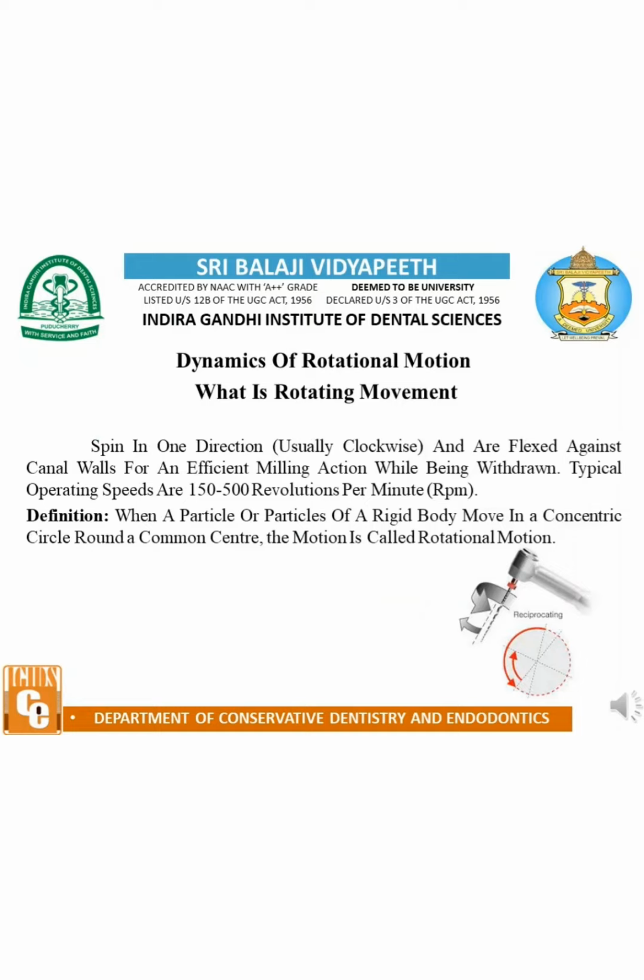Dynamics of rotational motion. What is rotating movement? Files spin in one direction and are flexed against canal walls for an efficient milling action while being withdrawn. Typical operating speeds are 150 to 500 revolutions per minute. Definition: when a particle or particles of a rigid body move in a concentric circle around a common center, the motion is called rotational motion.